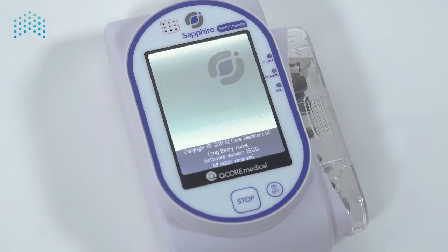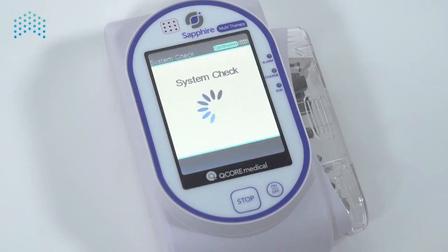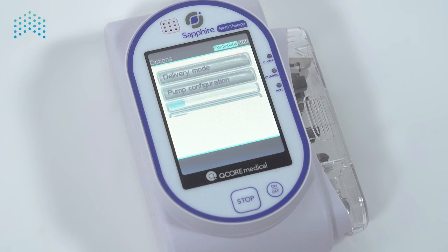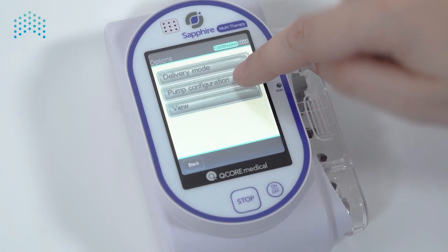Restart the pump to verify that the software boots up successfully and, if needed, define the pump's software language under the regional settings of the pump.